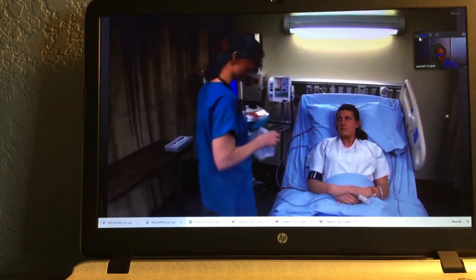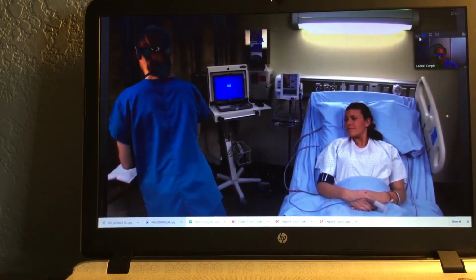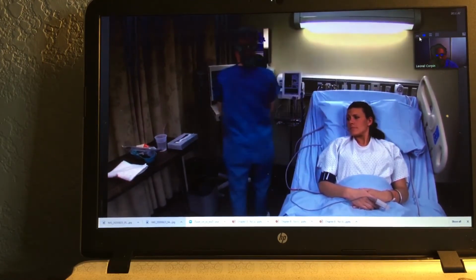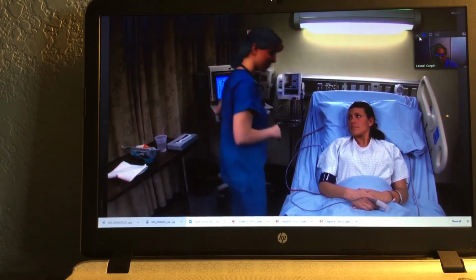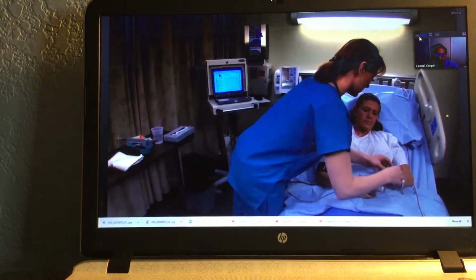Hi, my name is Angela. I'm going to be your nurse today. Ensure privacy and place your supplies near the client's bedside. Perform hand hygiene. Use 2 acceptable identifiers to confirm that you have the right client. Can you tell me your name and date of birth? Brooke Baxter, 313. And you're allergic to Keflex?